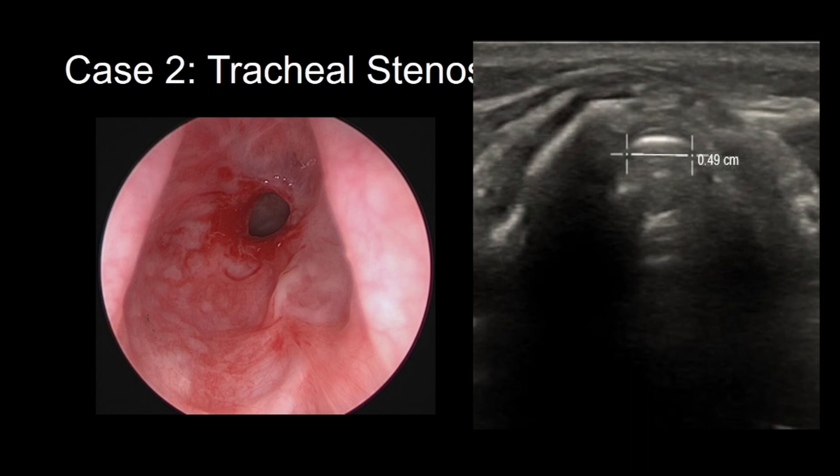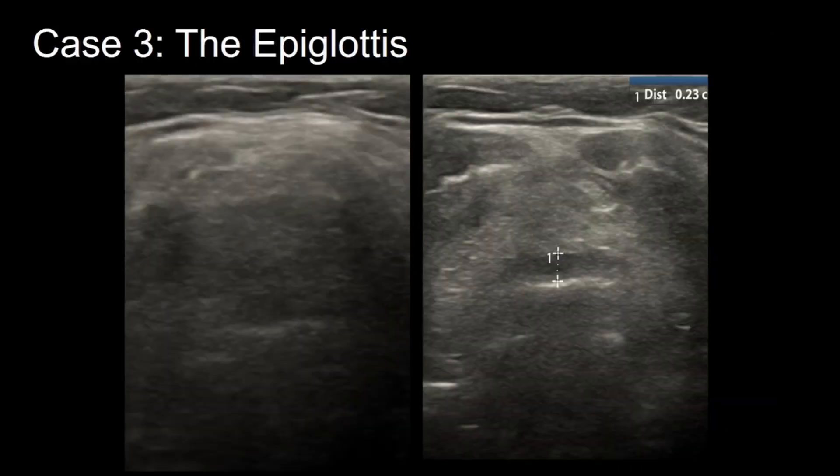This is another super quick measurement — you're just measuring a diameter and remembering that number: 1.5 centimeters. Anything below that, just be really careful. I think you're going to see a lot more of these cases, more so than ever before due to COVID. Before this I had never been measuring the trachea, and now I've seen so many cases of stenosis.